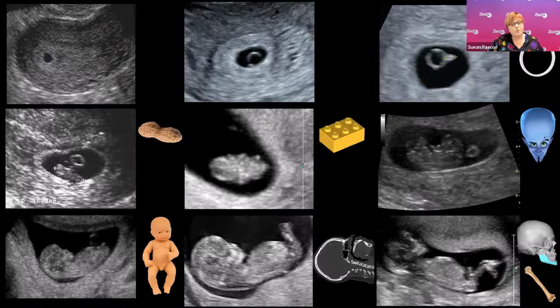And that's because one of the common mistakes that people make when they're just learning to do crown rump lengths is they make very inaccurate measurements, because they either include the yolk sac as the fetal head very early on, or they're taking an oblique cut, and so they foreshorten the crown rump length. And if we get the dates wrong at this stage, it kind of sets it up for the rest of the pregnancy. And so we want to try to estimate the gestational age by looking at, well, what fetal development milestones have been reached, what anatomy can we see, and then we correlate that with our crown rump length.